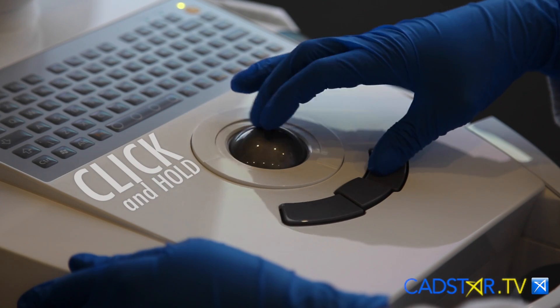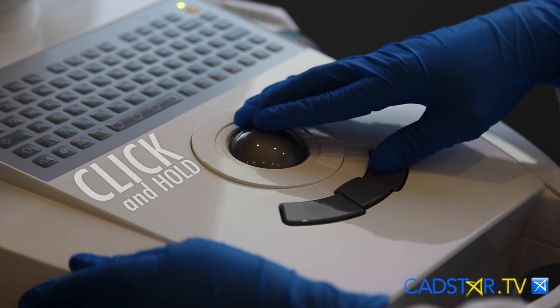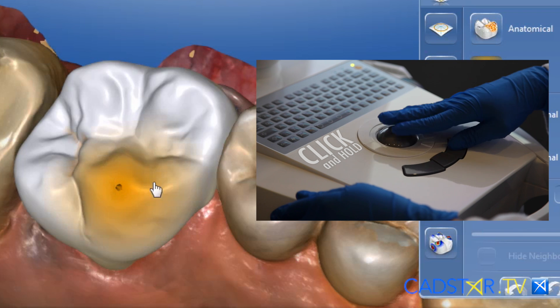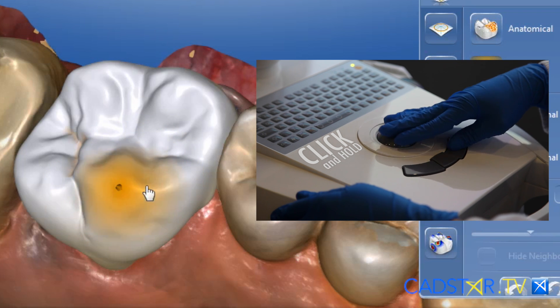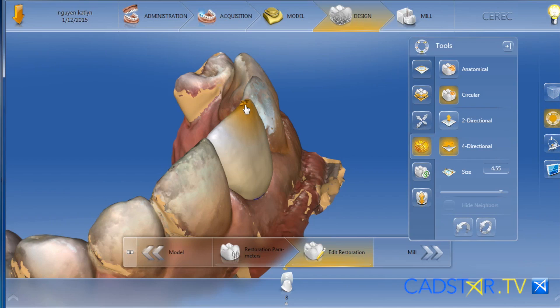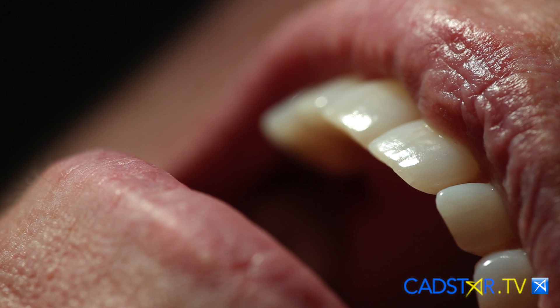So the circular two-directional tool is my favorite. The way you can control that paintbrush size is by holding down your right mouse and moving your trackball up and down. It's very rapid. You'll see that orange glow with the tapering feather effect that will define your active waxing zone on your restoration.